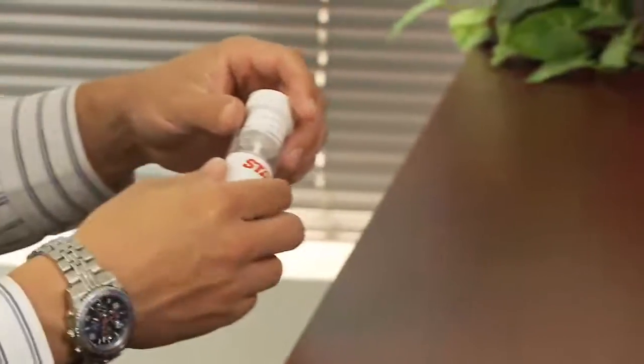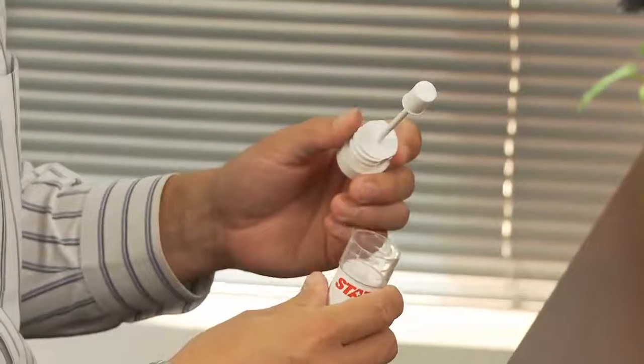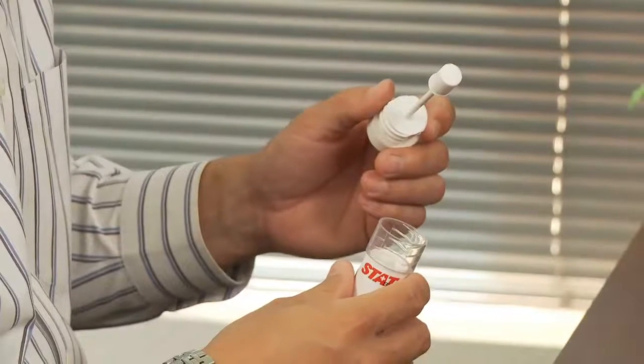Have the donor remove the collector cap and sponge from the collection chamber. The sponge will be hard initially but will soften as it absorbs the saliva. Step 2. The donor will then insert the sponge in his or her mouth and begin actively swabbing continuously for 3 minutes. Inform the donor that he or she may experience a sour taste after the first minute.